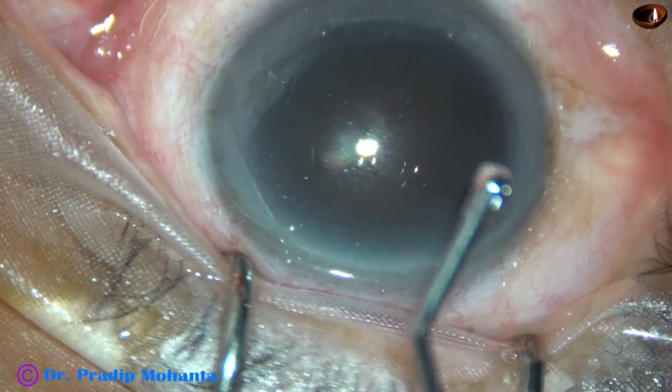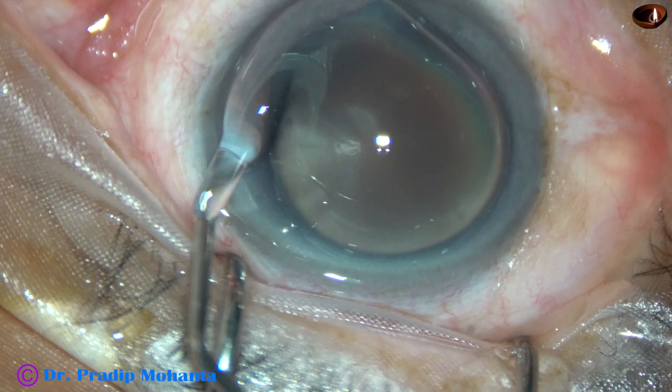Friends, welcome to my workplace at Ranaghat, West Bengal, India. This is a cataract nigra, a black cataract, a very hard cataract.